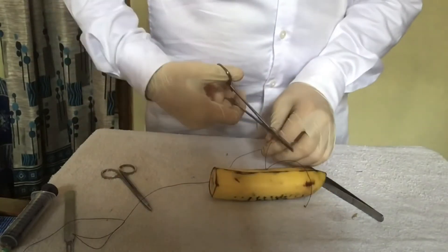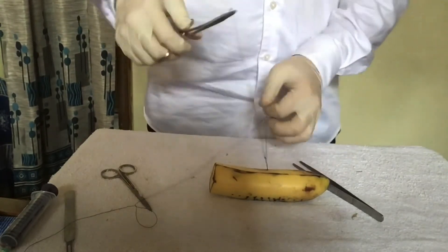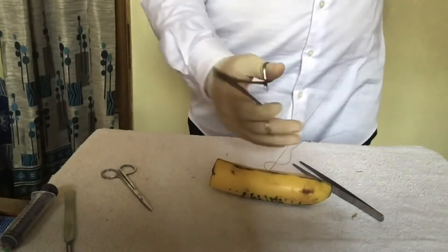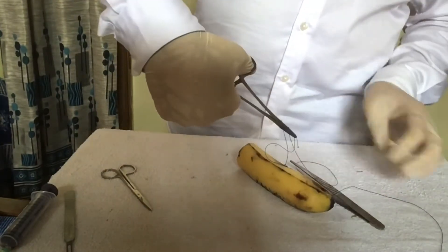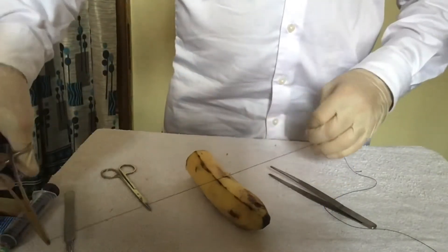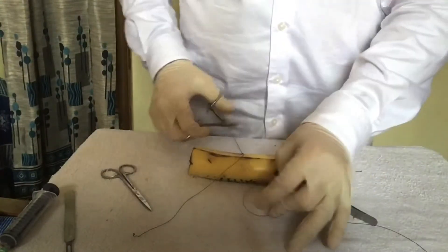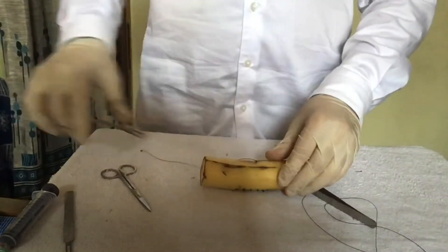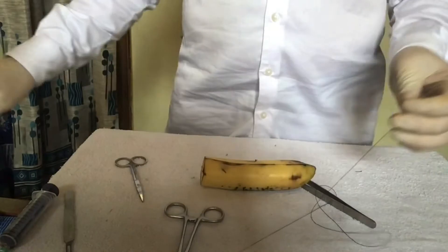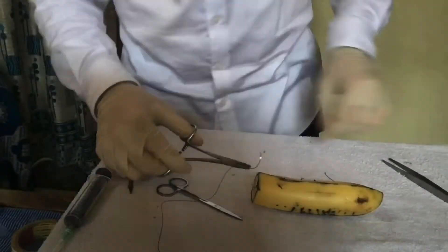Now tie the knot using the needle holder and tie it multiple times. It's better to keep the short end shorter so that it's easy to tie a knot. Now cut the extra suture. As you can see, in vertical mattress the knot is at the same side.